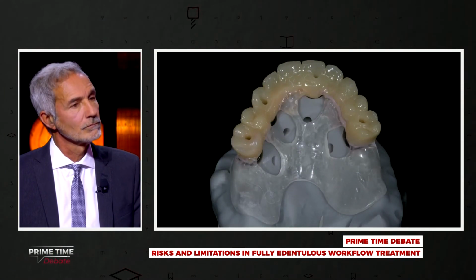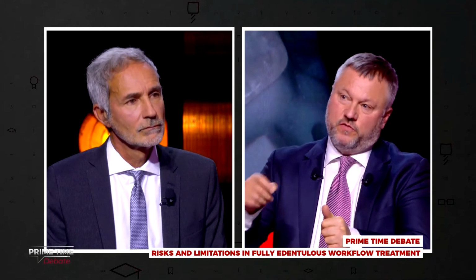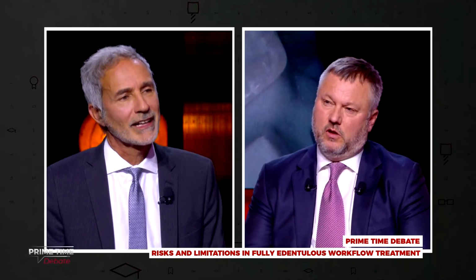I think, Sergio, it was an important point that Tali made, that when you use those fixation pins, this is only as correct as your stabilization on the soft tissue when you fix the pins. Yes. But after you fix the pins, of course, you are fixed in that position. But it's basically a tissue-supported position. Of course, you must be very careful.